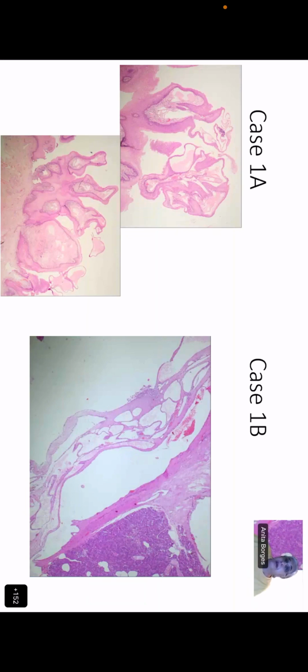So do you get why, or when, we should limit the word papilla? It means that there is a proliferation of an epithelium above the surface, into a lumen or whatever way you want to describe it, but that it drags along with it its fibrovascular core.